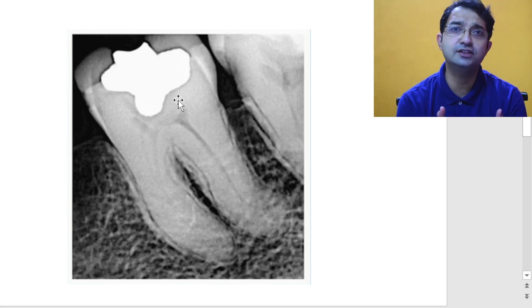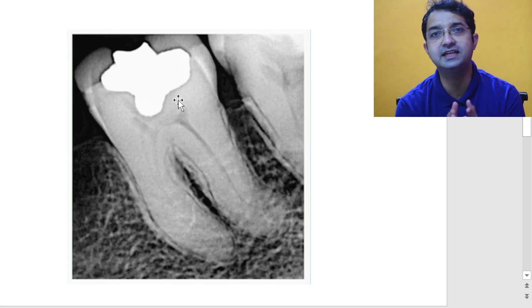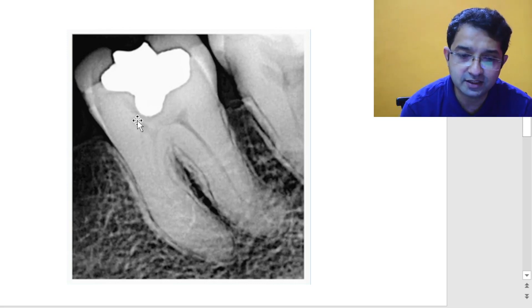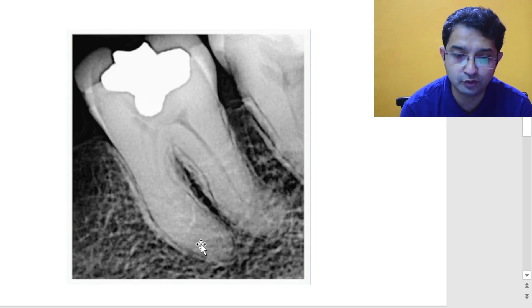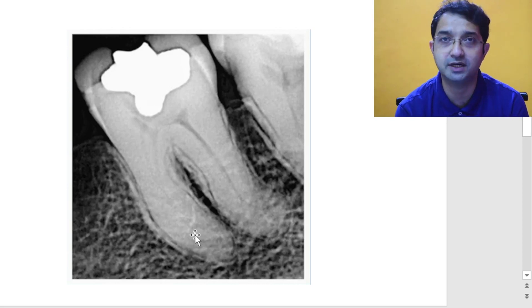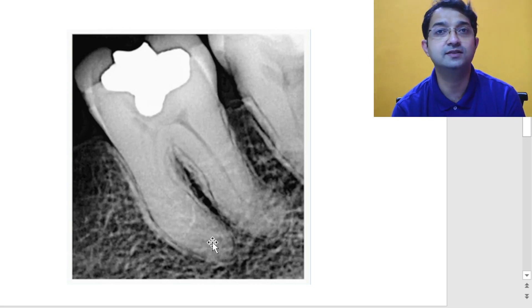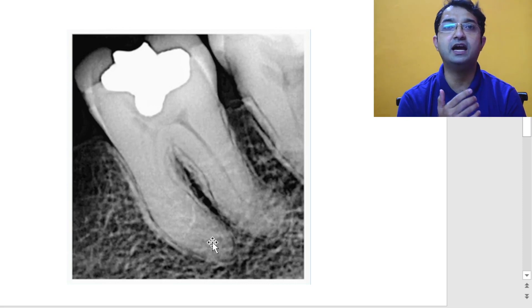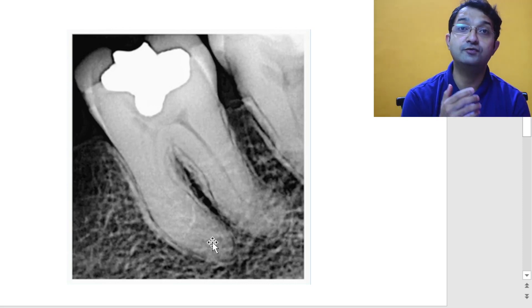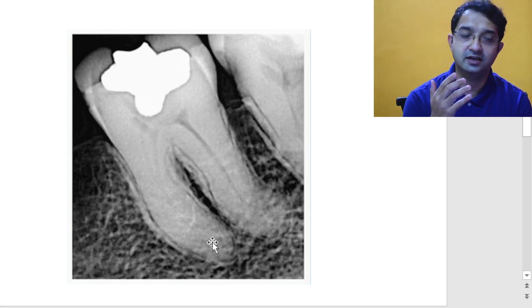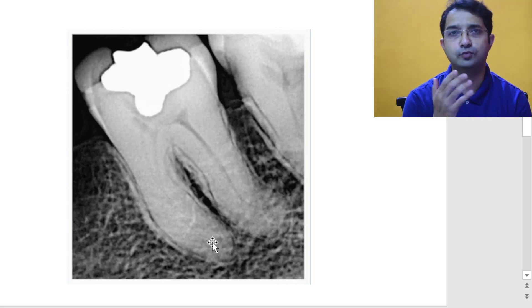In such situations, it is always better to take mid-treatment radiographs if you are finding it difficult to locate the canals. Apart from that, you can also appreciate that in the mesial root you cannot see the root canals. In such situations, if you have a very thin canal or cannot see the root canals in the root, you should be ready to enlarge the canals with smaller instruments.